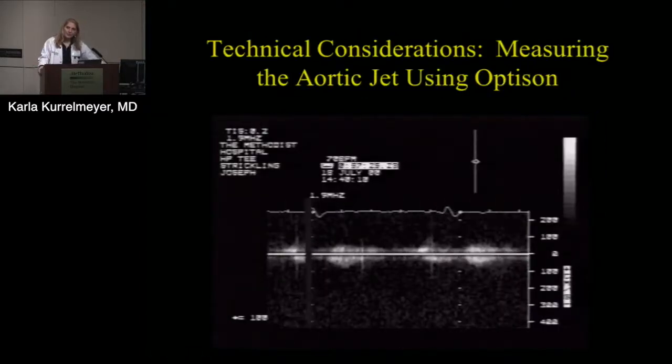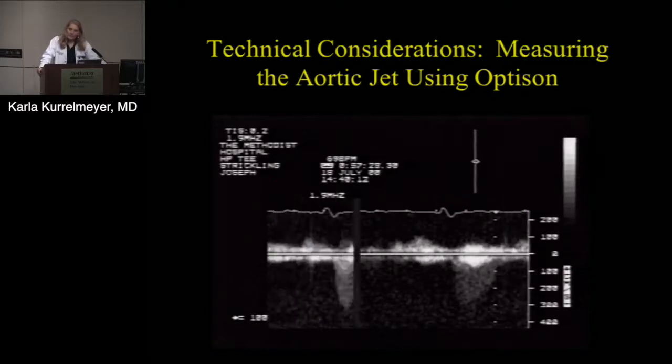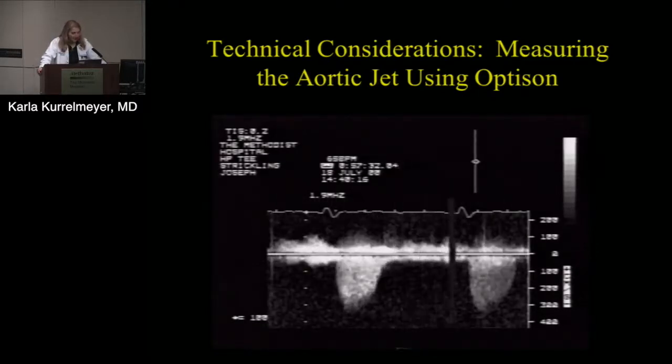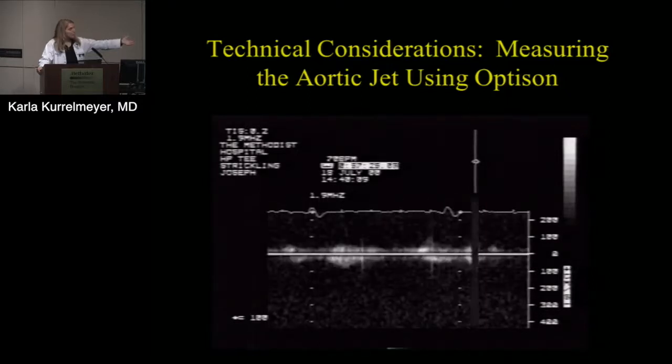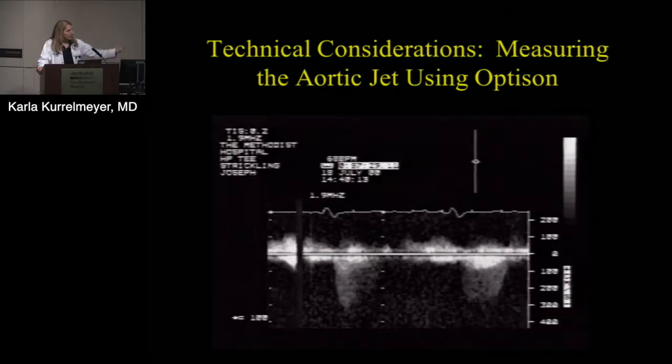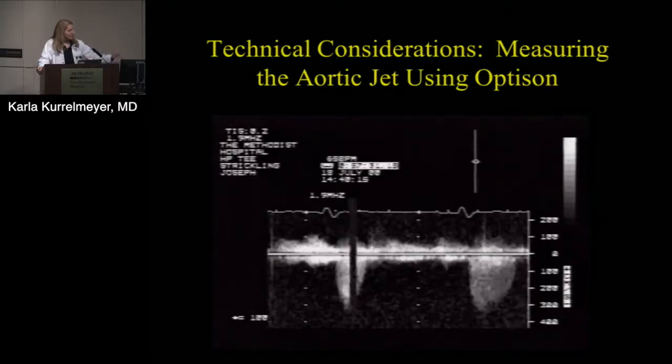If you can't get it using the PEDOF probe, well, then you can always resort to using Optison. So in this particular case, what you see at the very beginning is there's no signal whatsoever. But then as the Optison comes in, you can see that there's a really nice traceable curve.